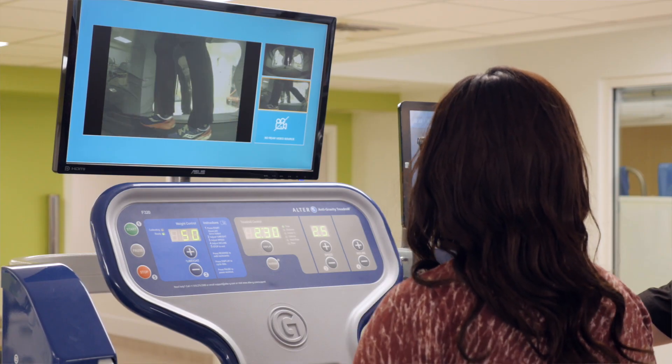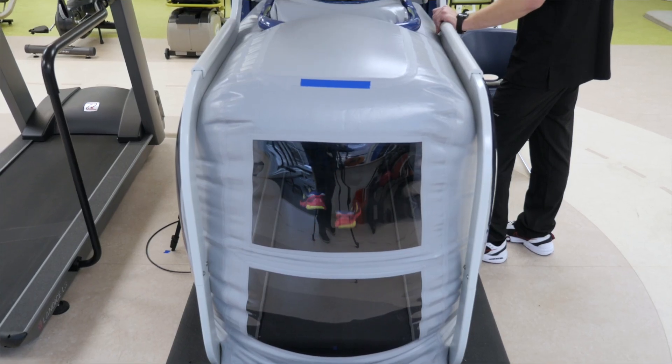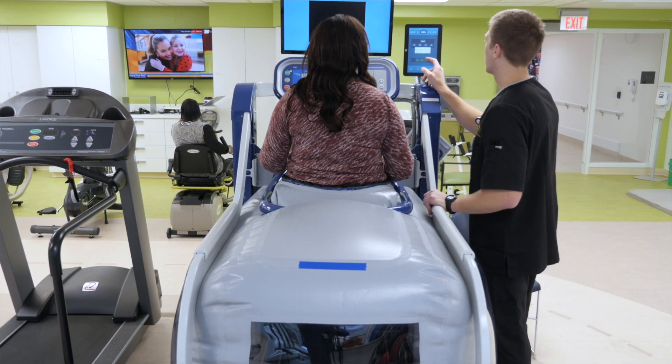We can use criteria like weight-bearing symmetry, cadence symmetry, and step length symmetry, as well as their pain level. It also really helps with patient motivation — they can start doing things that they like and love to do sooner than they were able to before.